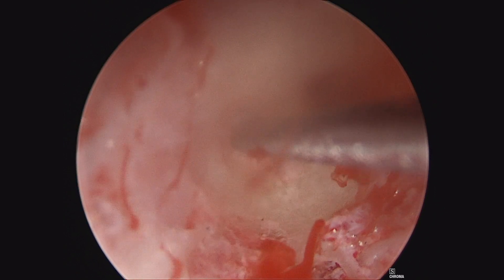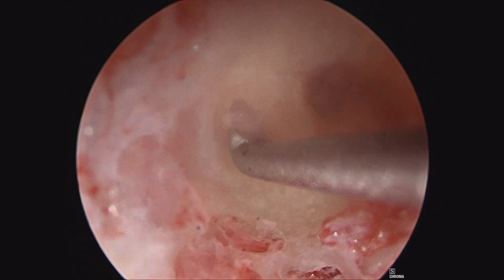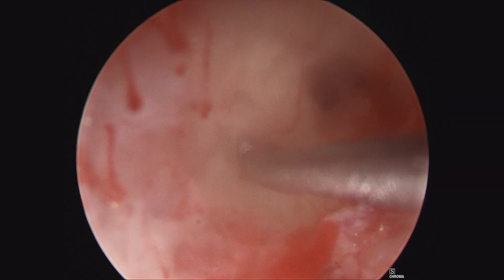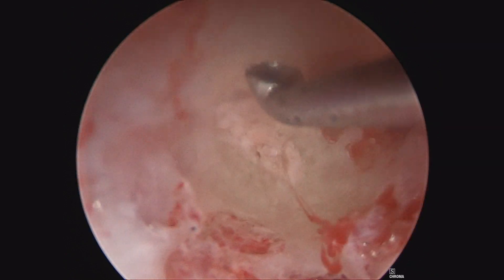Bone pate from the patient, taken as powder, is mixed with fibrin glue and forms a paste that is then packed into the arches of the semicircular canal. You can see that saline needs to be continuously rinsed to clear away blood and other materials.